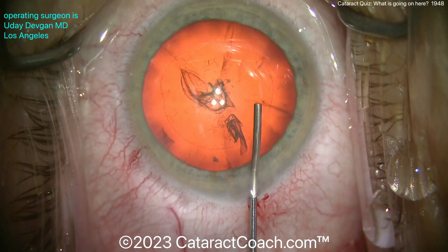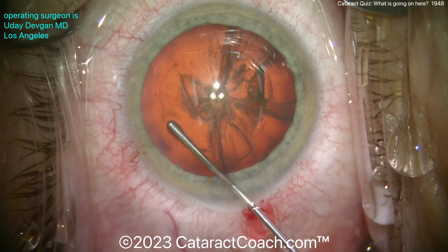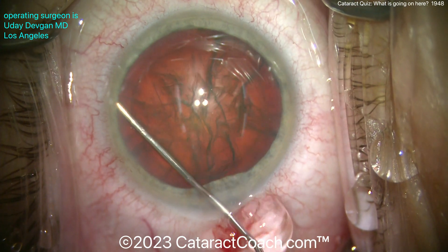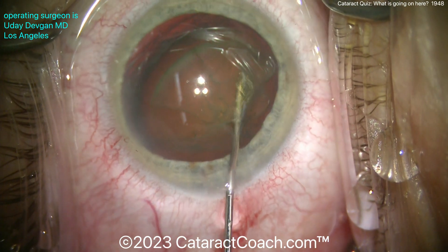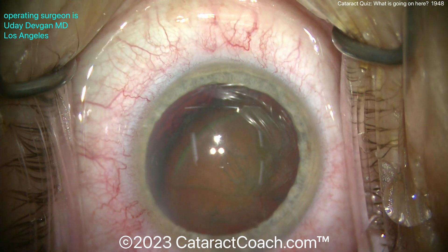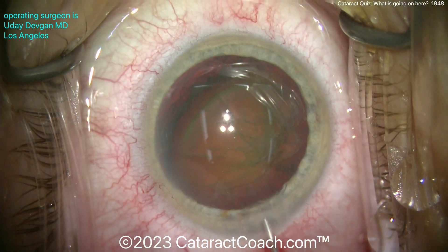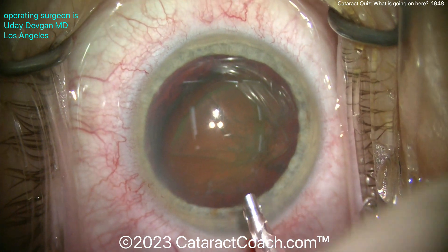Now for the hydrodissection — I'm going to try to get this nucleus partially tilted out of the capsule bag. It's not too dense, not too much nuclear sclerosis, kind of a moderate cataract. There it is coming up out of the bag. Let's tilt that up a little bit, maybe even a little hydrodelineation, and maybe another aliquot of BSS to protect that central corneal endothelium. This nucleus can now be easily chopped and emulsified.